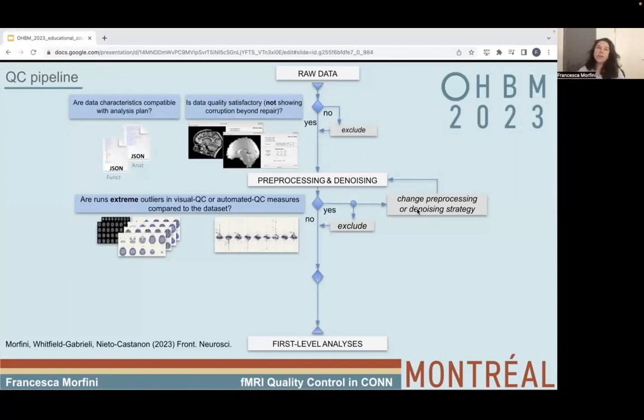For example, if the distribution of the normalized anatomical norm ANAT metric was homogeneous across my data set, but from a visual inspection point of view, although very homogeneous, the normalization looked like it had performed poorly, one might decide to take a step back and reprocess the raw data using a different brain template, and then reassess how the data set as a whole is performing.